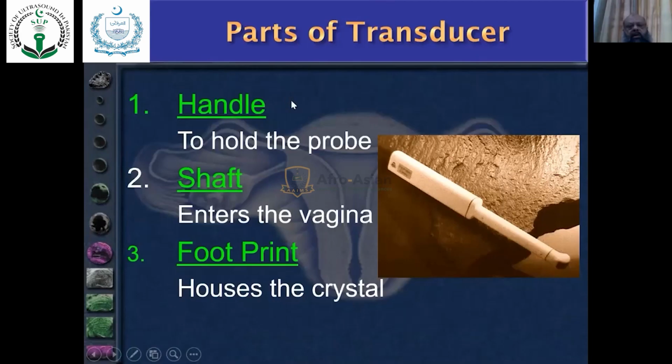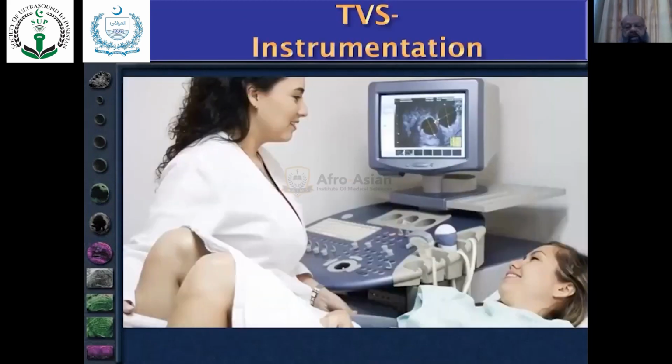The second thing which is part of the machine is the transducer. We know that the same machine is used for all types of modalities of ultrasonography.